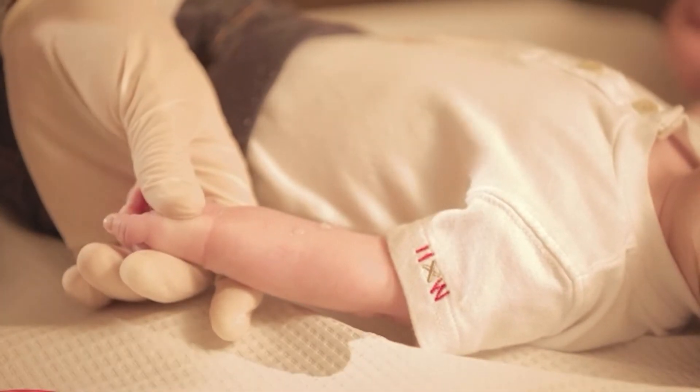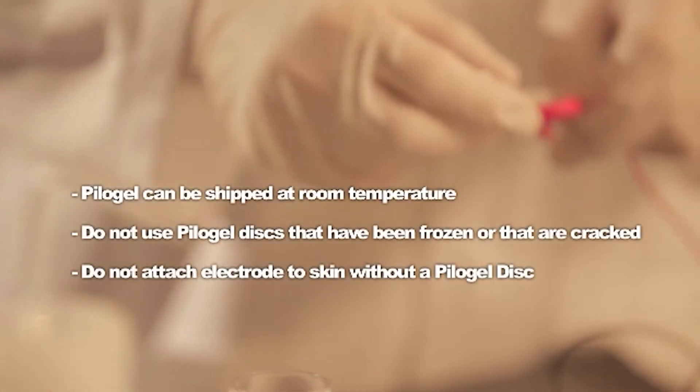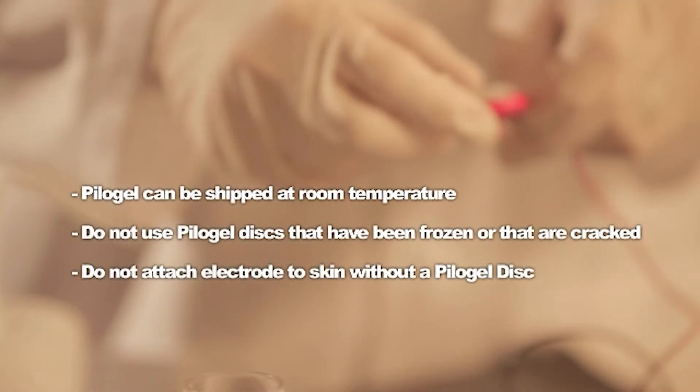Place a drop of water on the skin prior to the pilot gel disc attachment. This will help ensure uniform contact over the area and may reduce the possibility of a burn. Remove the pilot gel from the container.